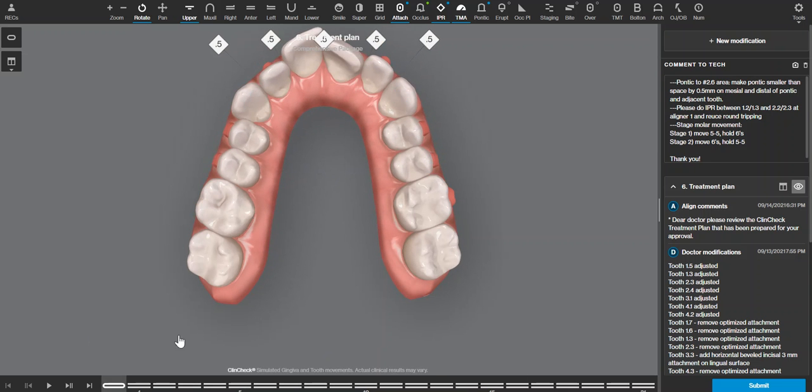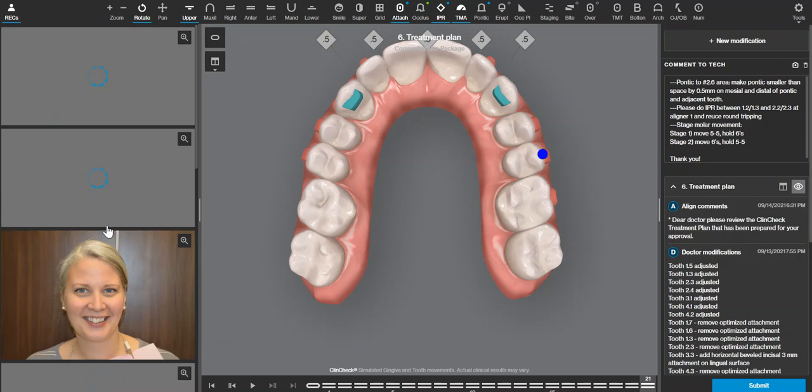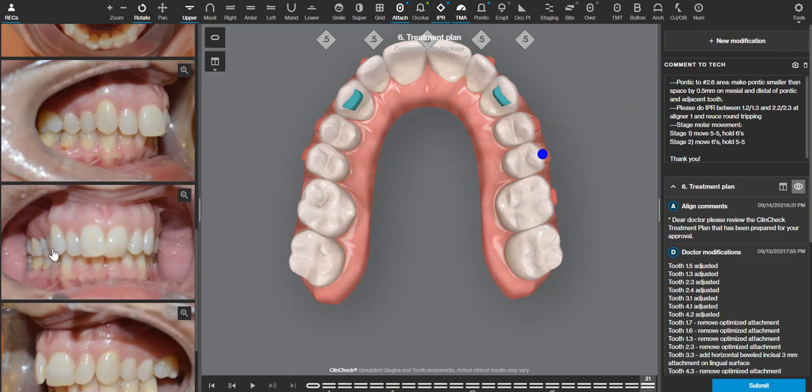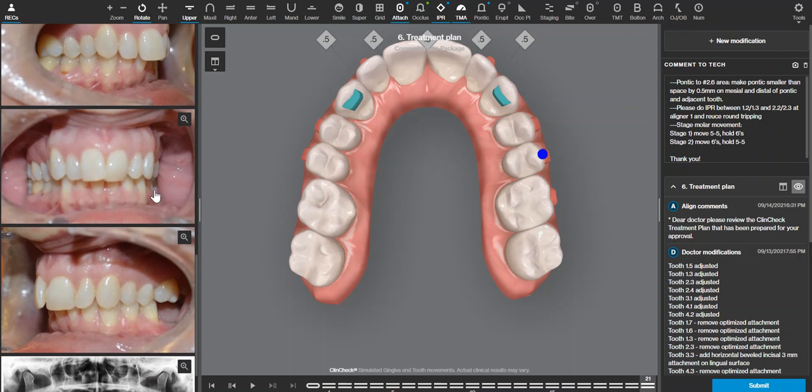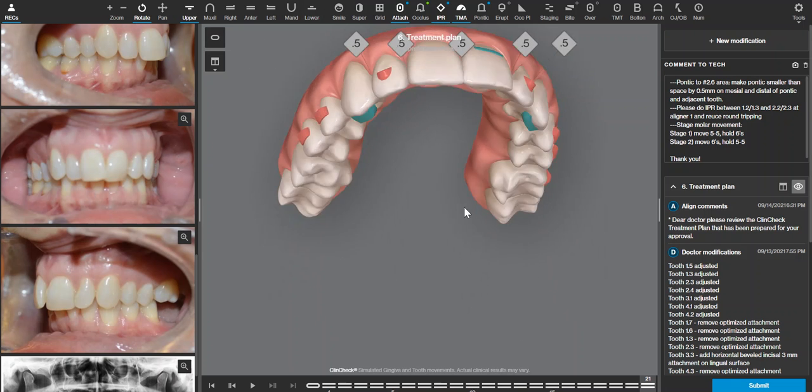premolars look much more buckle than the molars do. I'm going to check her buckle plate and there's no exact number unless you're looking at a CT, but based on these curvatures I think she has enough room to expand or procline through the molars.